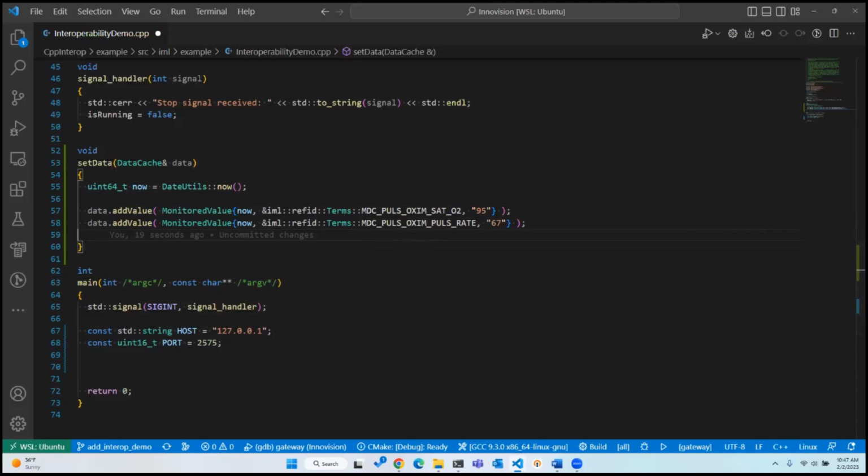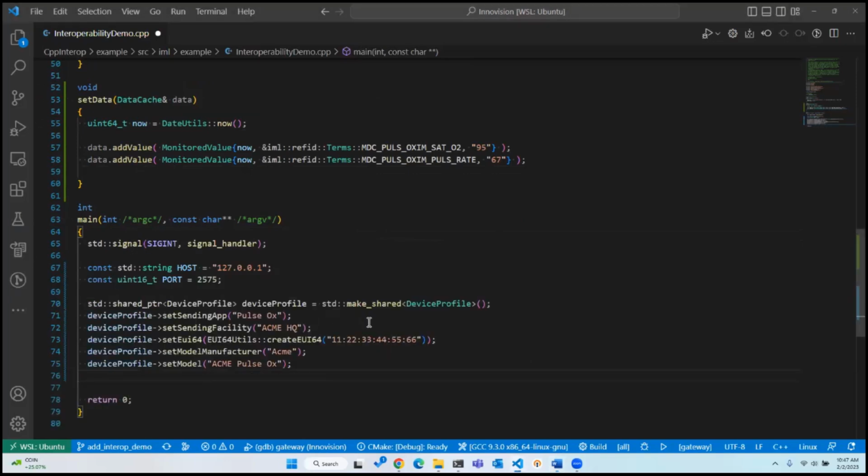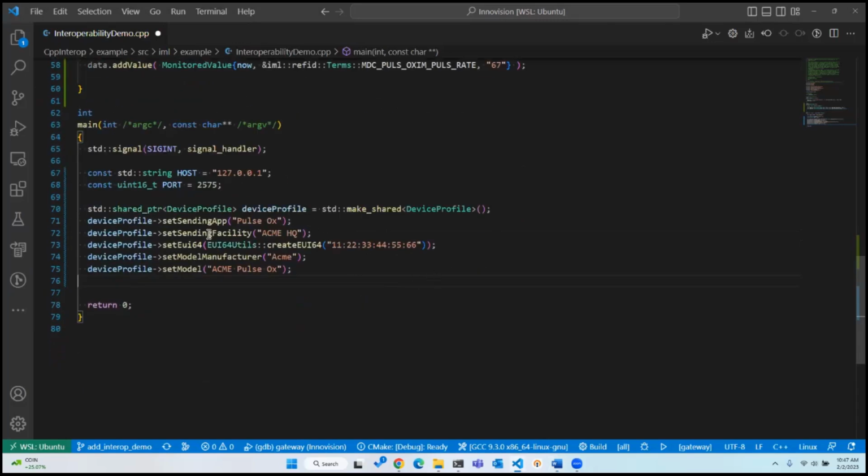So the next step is to define some information about your medical device. So we're going to do that using the device profile. And here's the data that we're defining. So like I said before, we are a pulse ox, and we're located here at the Acme HQ.